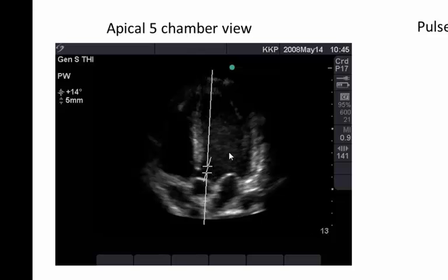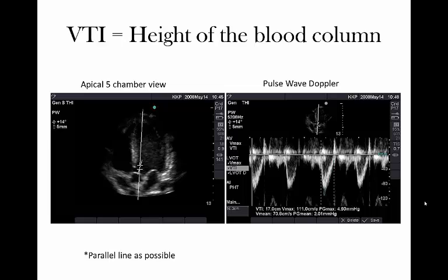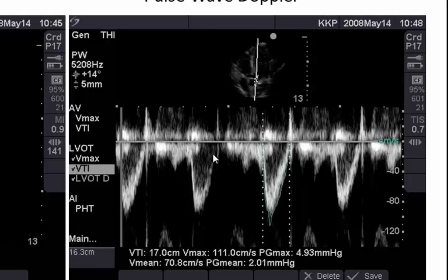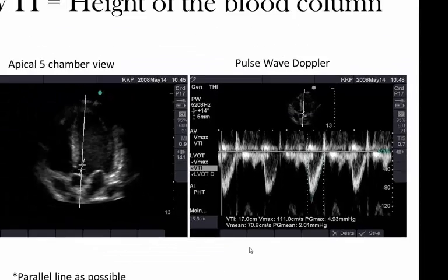How do you get the LVOT in a parallel alignment? That generally comes from your apical 5-chamber view. Some of you generating apical 3-chamber views may also have a good view, but most of us will choose the apical 5. Once you engage the Doppler signal at that site, you'll reliably get a systolic event represented by a nice flow envelope corresponding to one-third of the cardiac cycle. The other two-thirds are going to be a diastolic event. Some people choose to do this with an EKG tracer, though many of us at the point of care recognize that it is less practical.